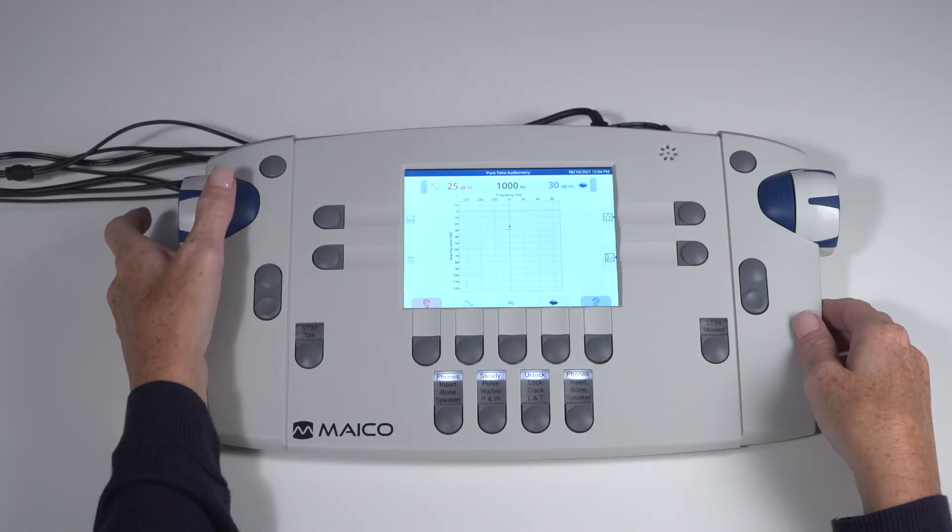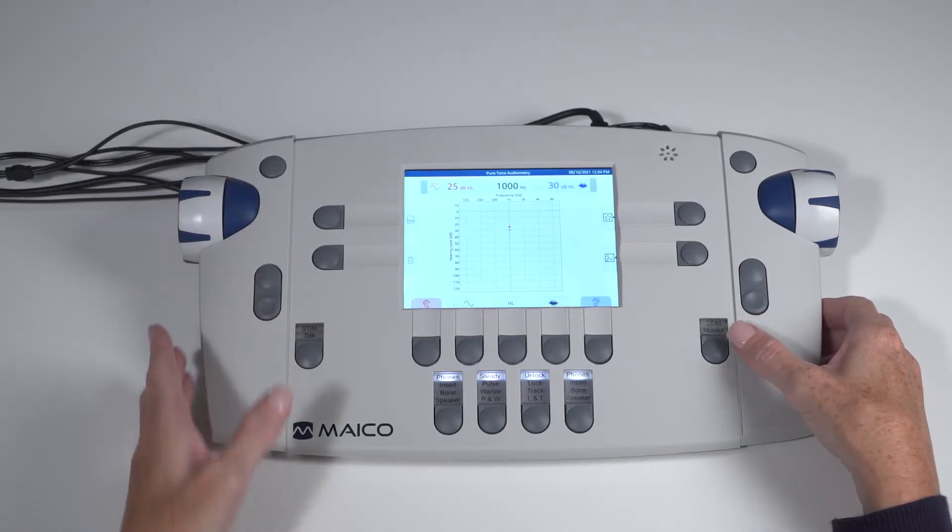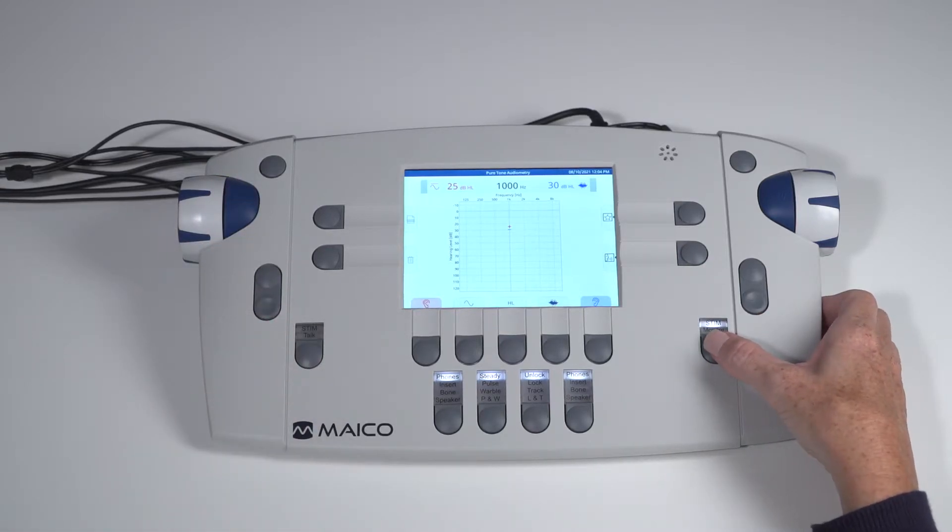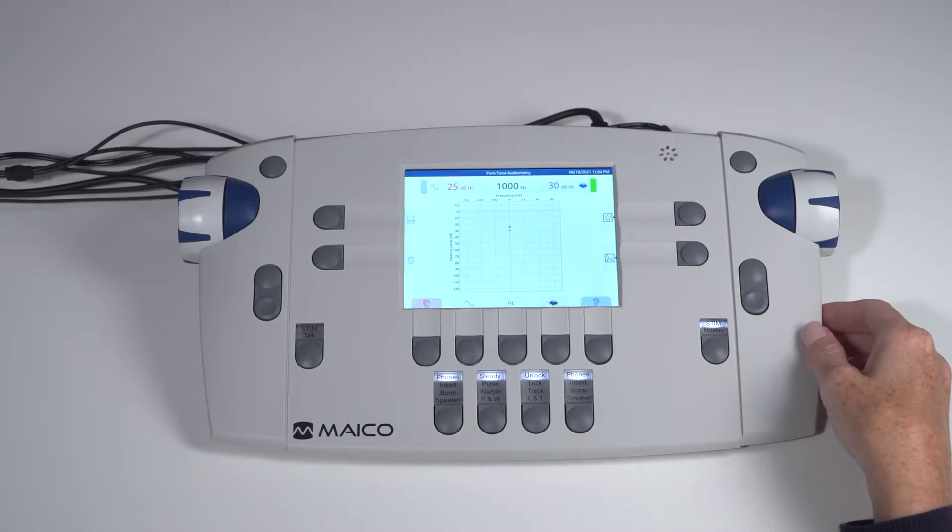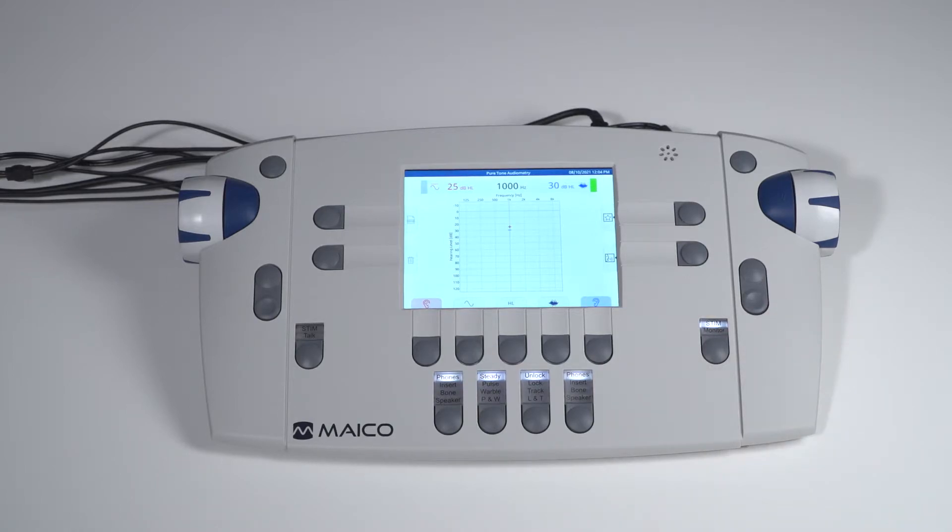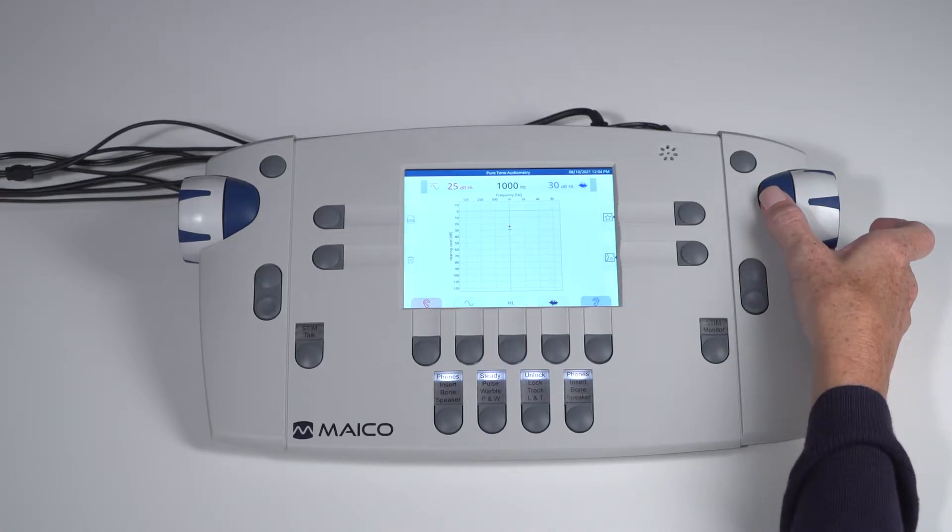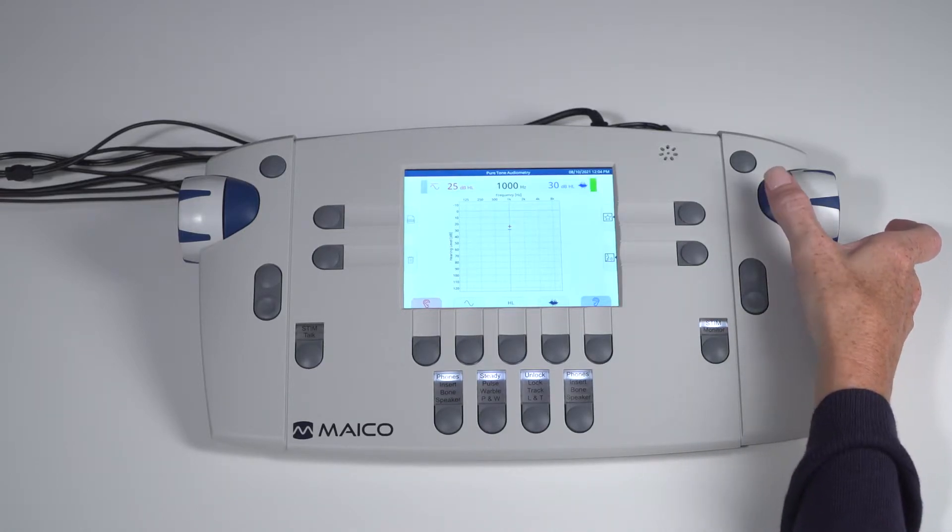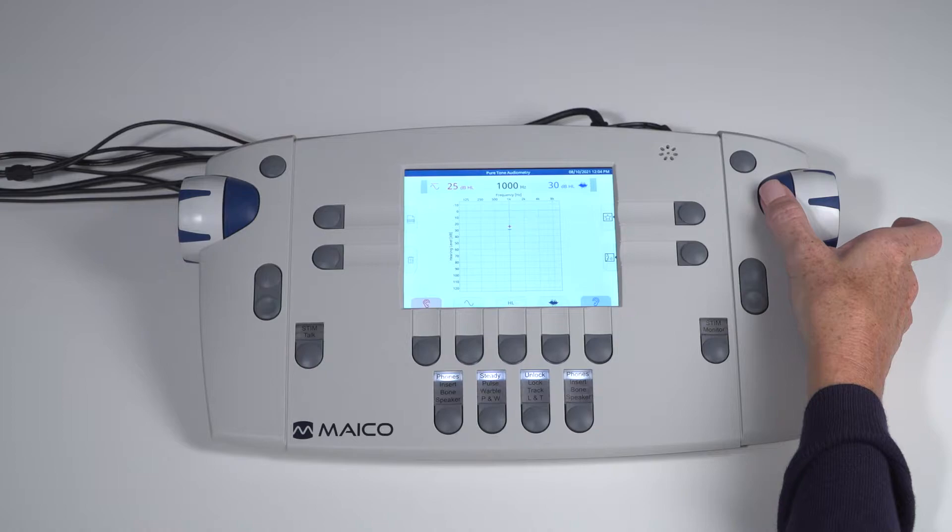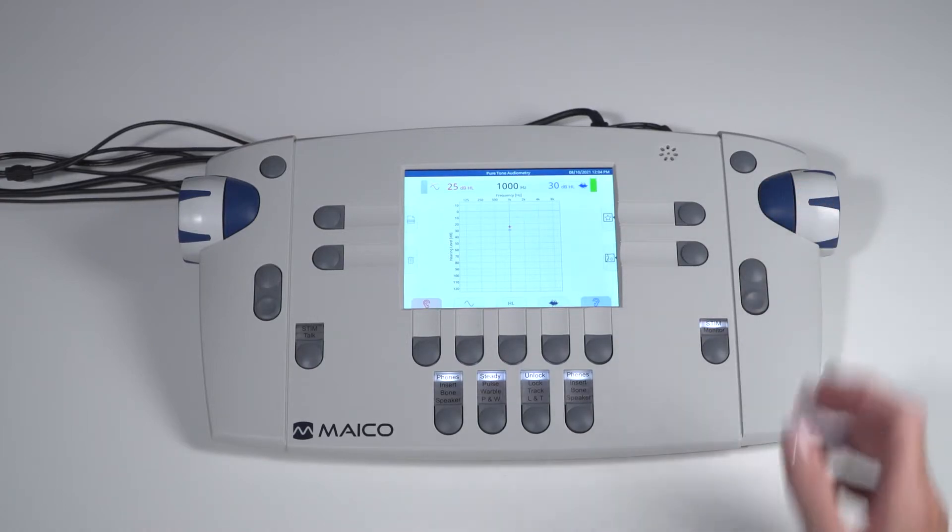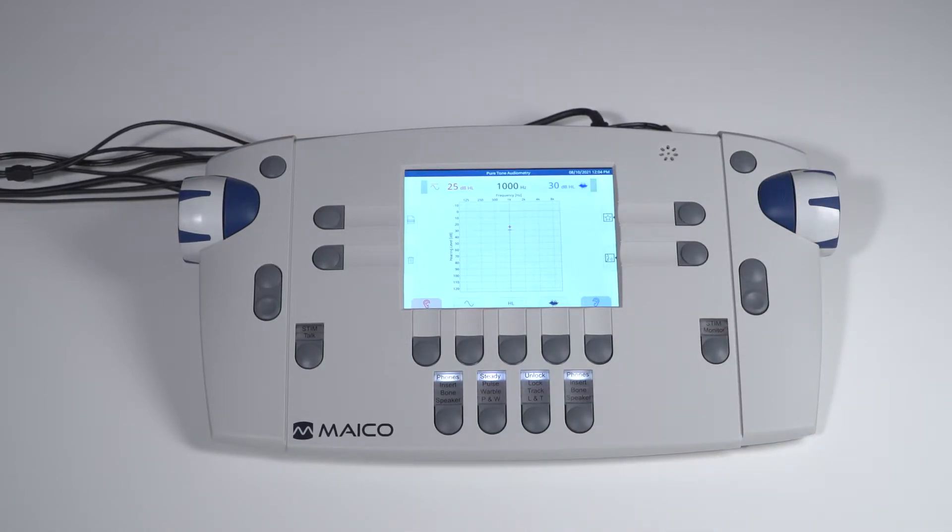To present a constant stimulus for masking, or the tone for interrupter mode, select the stim key. This turns on the signal and pressing the blue presentation key will then interrupt the signal. Press the stim key again to toggle back to regular presentation mode.